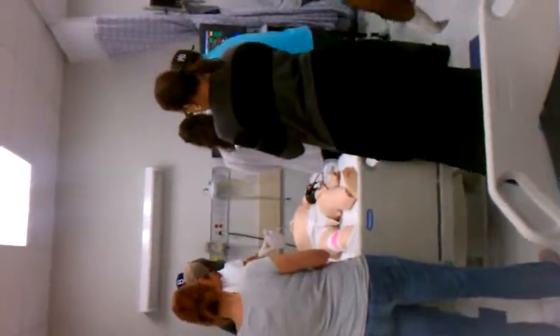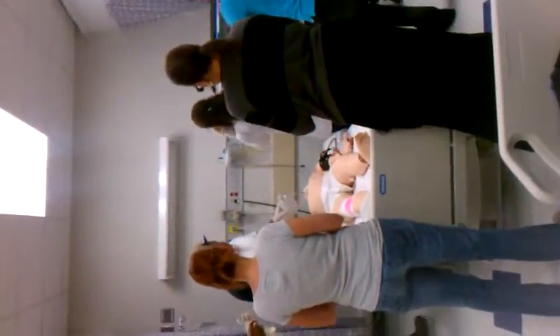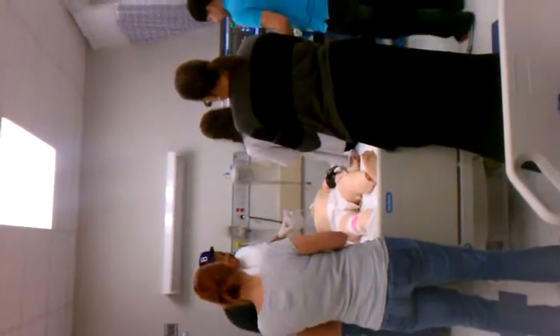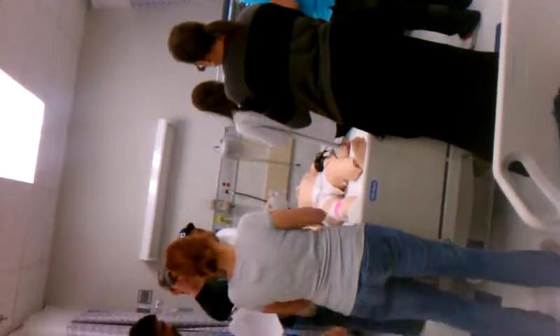He's on assist control mode, rate 12, volume is 750. FiO2 is 45, PEEP of 5. Now, do not put him on the ventilator, because he won't ventilate. We all ventilate. FiO2 45?